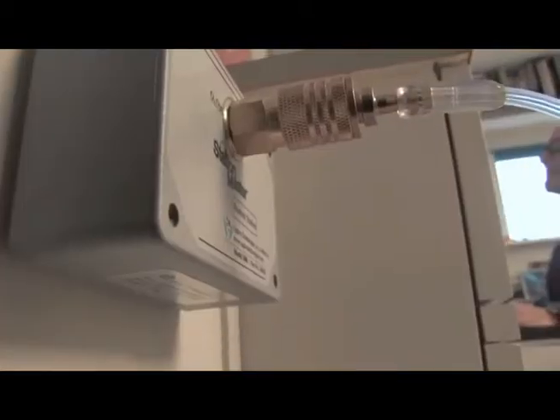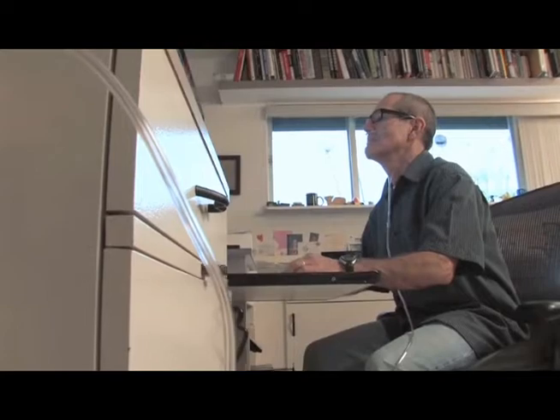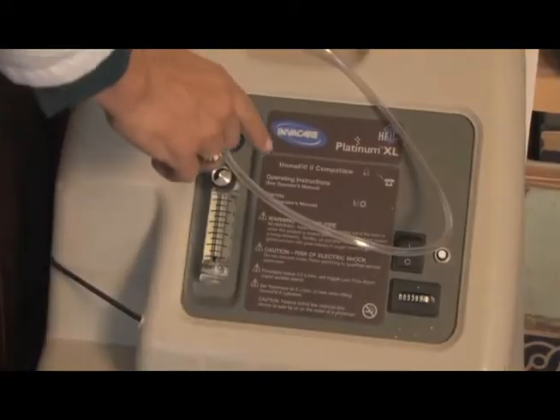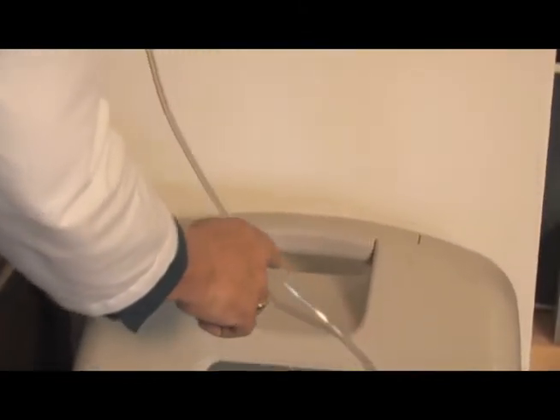Use the oxygen source you currently have. The StationMaster works with concentrators or liquid systems. No electricity is required. StationMaster uses the natural flow of your existing system.